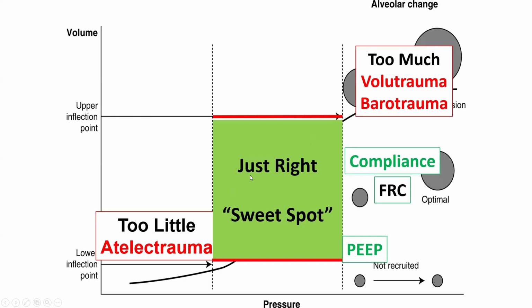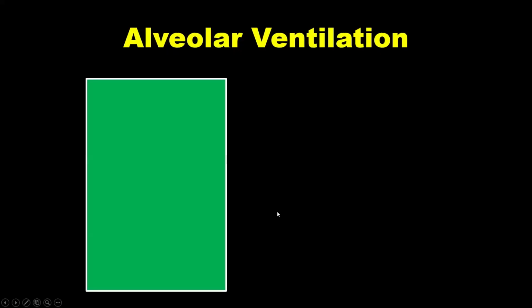Again, in the competencies, when we talked about lung recruitment and these patients, if they sit on the vent on day 1, day 2, day 3, day 4, on the same setting, same position, air going in and out 24/7 back and forth, they're going to collapse. Again, they're not going to stay in the sweet spot. And that's what the recruitment maneuver is for, get them back here. Well, we're going to use APRV in the same way, to try to recruit that lung, and not only recruit it, but try to keep it open.